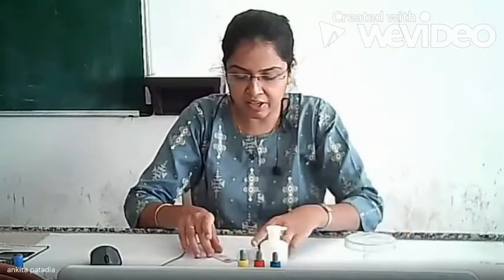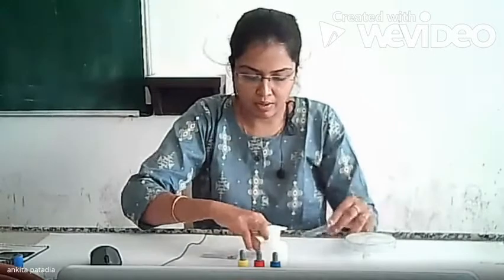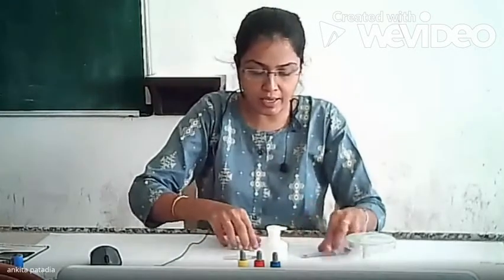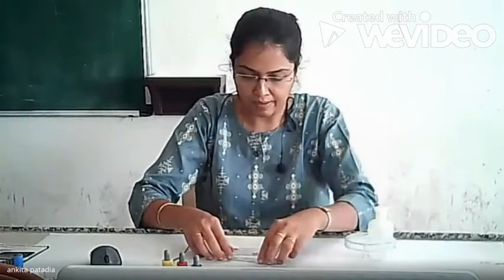Now we are having a 3 cavity slide. We have already marked it as A, B and D. Before using, just clean the slides and cavity.